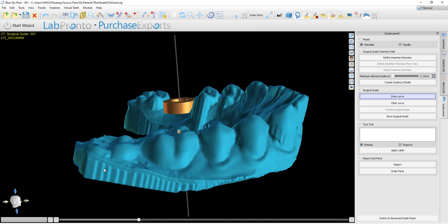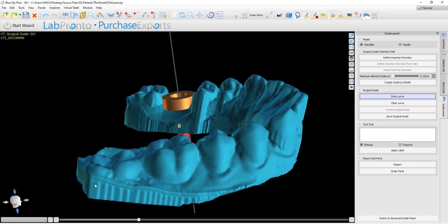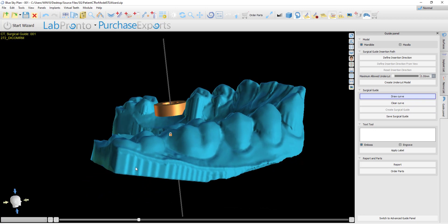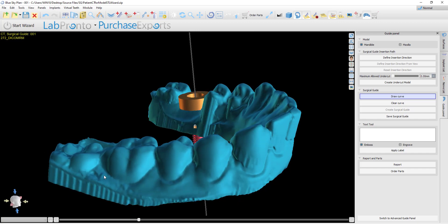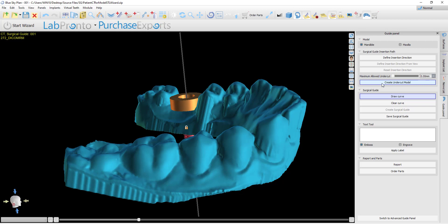The two main takeaways from this video are: number one, if you do not define a custom path of insertion and rather use the recommended default by the software, you will see that the software automatically generates the model with undercuts removed, and that is the model that should be used to draw the curve and create the surgical guide. Number two, if you define a custom path of insertion, make sure to click the Create Undercut Model button before proceeding to draw the curve and creating the surgical guide.